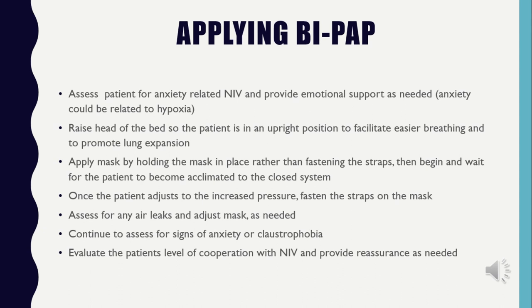And also, when you're applying the mask, use the quick release straps. That way, the top part of your mask is already fitted to their head, and if you use a quick release, the fit will go on easily each time with application.